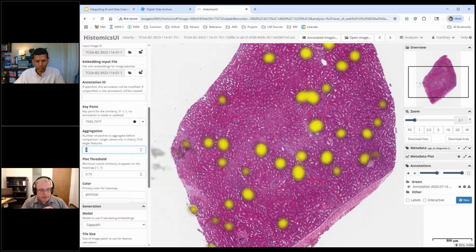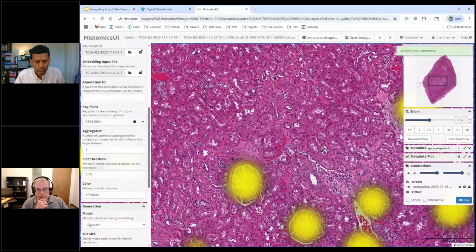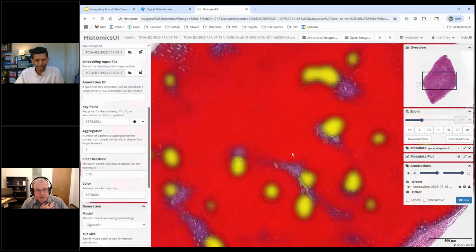And so if I click on a different area, we'll make another color to show things off. So I'm going to say, let me show something in red, and I'm going to click another point. And I'm going to say, hey, maybe I could find this tubule here. And if I click on this, it decides that a lot of things look like those tubules. And then there's some areas that aren't. And then glomeruli are distinct, so it said those aren't glomeruli, those are whatever that region is. And now you get to the point where it's clear that I'm not actually a kidney biologist, because I can't tell you whether that makes sense or not, other than that it looks like something occurred there, and then why are these regions not showing up?